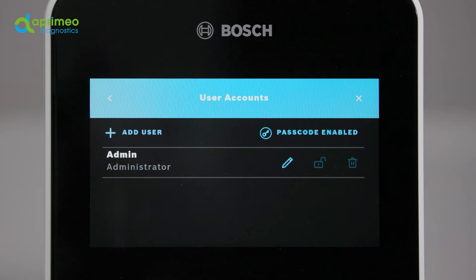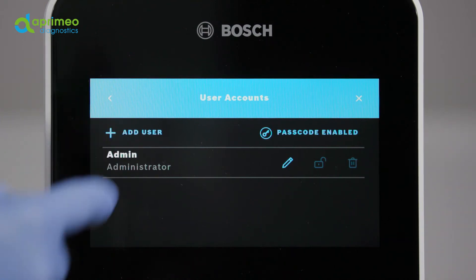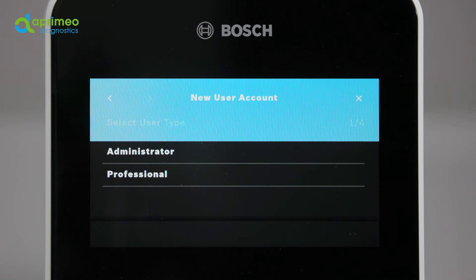Select the key icon in order to activate or deactivate the password protection for the user accounts. Select the pencil icon in order to change the name and/or password for an existing account. Select the lock icon in order to unlock or lock an account. If you want to delete a user, select the waste bin icon.